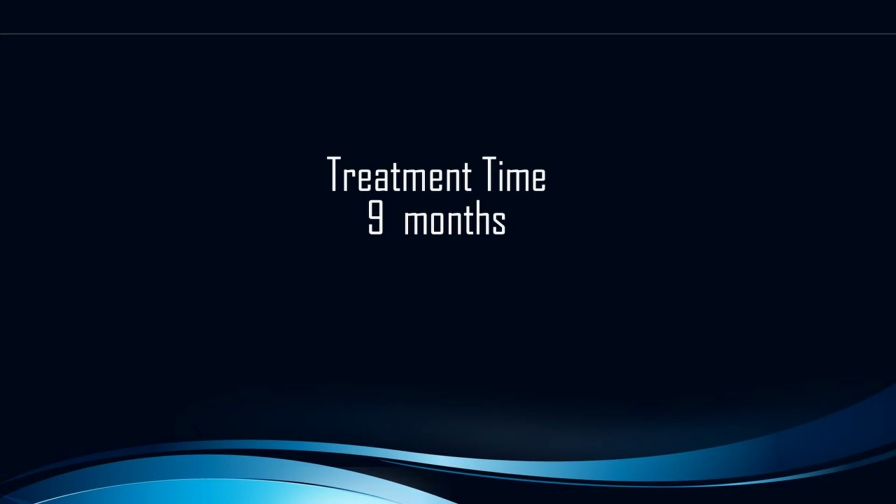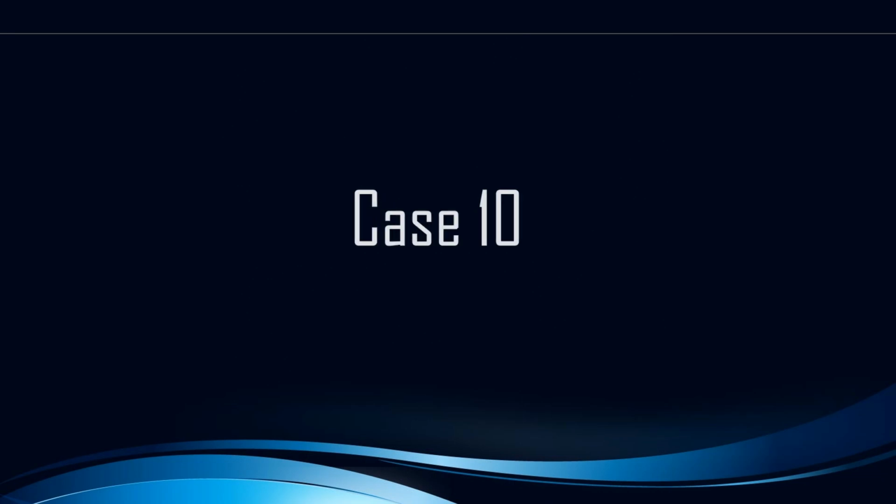And like I said, I'll just go back to his case, 15 years in the making. Most of that happened in about 9 months once we finally did get started in 2023. Case 10, our final case for today.